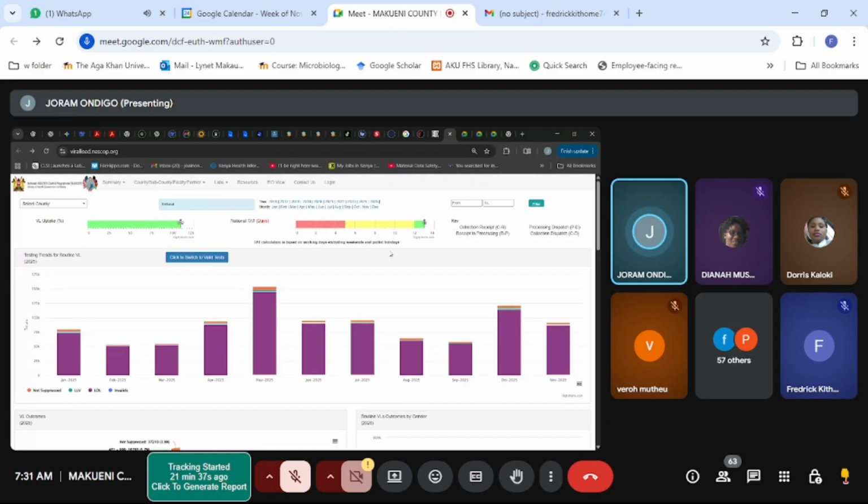Then processing to dispatch is the green, around 1 day, because here as a testing lab, most of them are accredited. There's a bit of review of the results before results are dispatched. Usually takes a day's work. So that's why it takes a day and then you get your results. So nationally, our TAT is around 13 days, give and take.